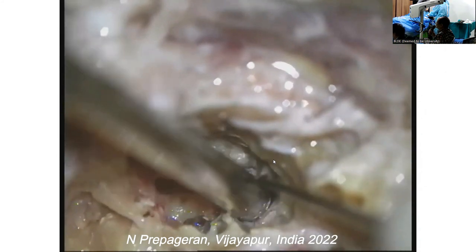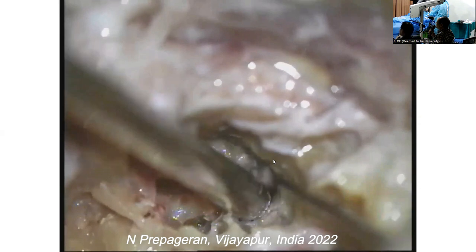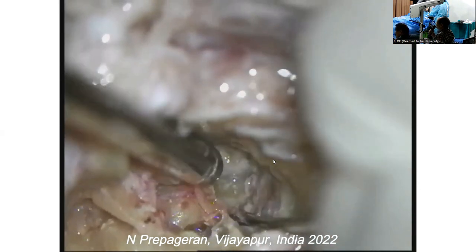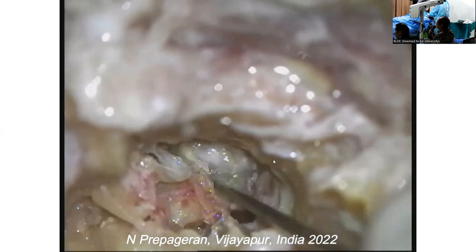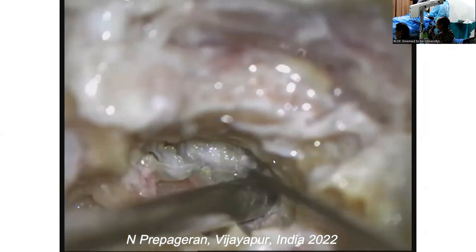Look, a lot of blood, guys. I think I'm taking the whole blood from his whole body right now. This is the Phelps sign. Can you see? And this is the bone between the carotid artery and the jugular bulb. Phelps sign is obliteration of this bone.